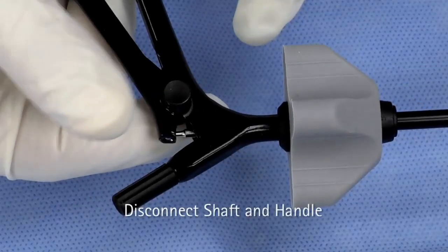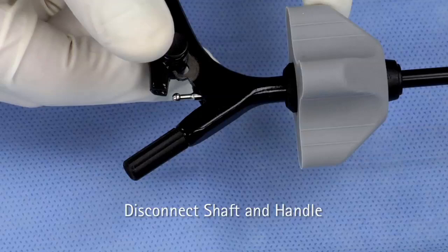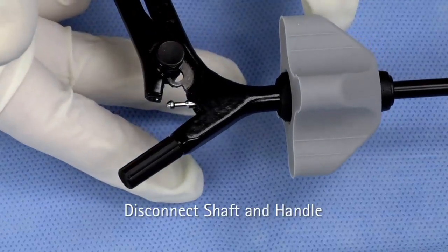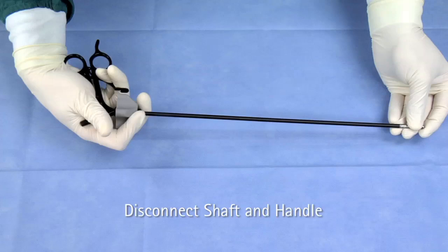Depress the black handle buttons on both sides of the handle and continue to depress. Pull the rear ring down to release the ball of the jaw insert. Release the buttons. Pull back the rotation knob and pull out the shaft with the other hand.